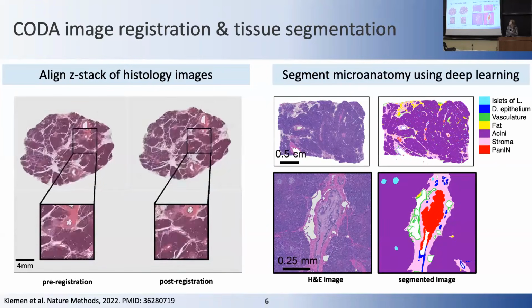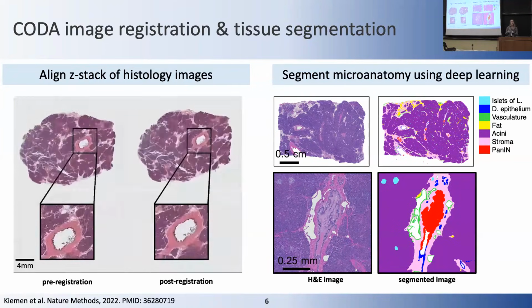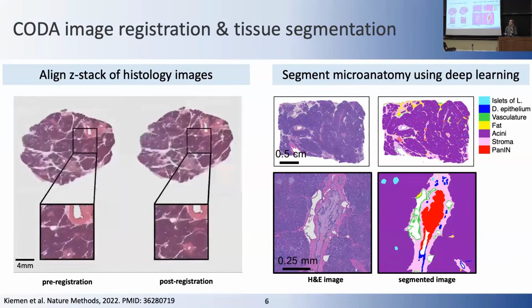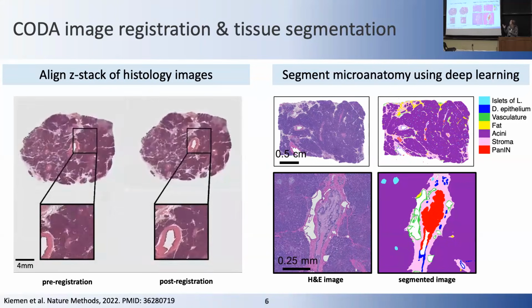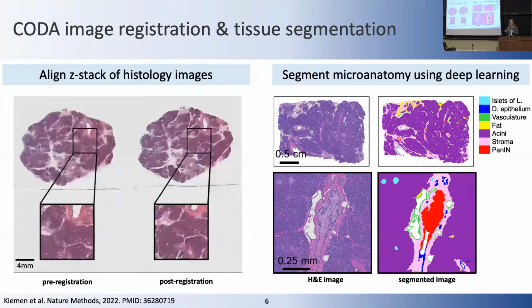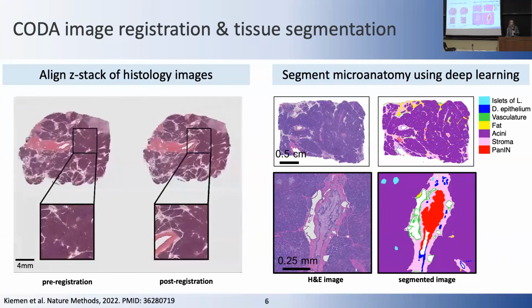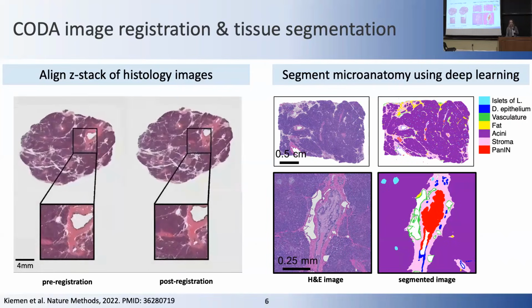We use a segmentation-based technique to use a set of manual annotations that can be customized to any tissue sample that we analyze, and allows us to automatically detect the types of tissue that a pathologist could see in H&E. What's so special about that is no single antibody could be used to stain all of a Panin cell without also staining something else. So if you stain epithelium, it's going to also stain the healthy ducts. If you stain with subtypes of mucin, as we'll see, it only stains some Panins. So we need a technique that utilizes H&E and detection in H&E to study these lesions.